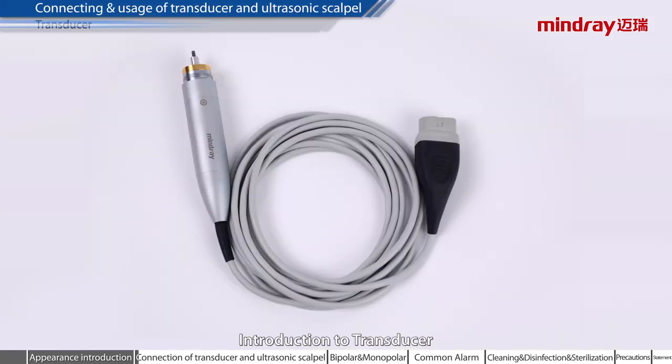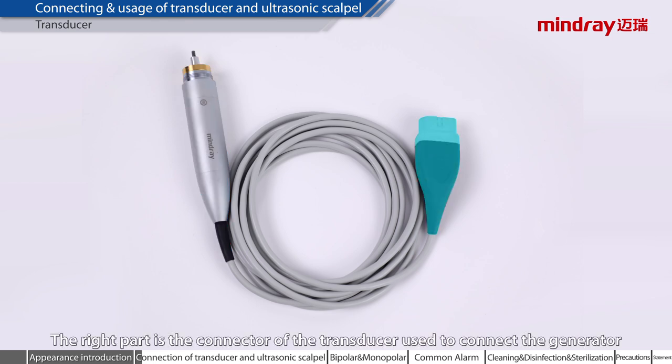Introduction to transducer. The left part is for connecting the scalpel. The right part is the connector of the transducer used to connect the generator.